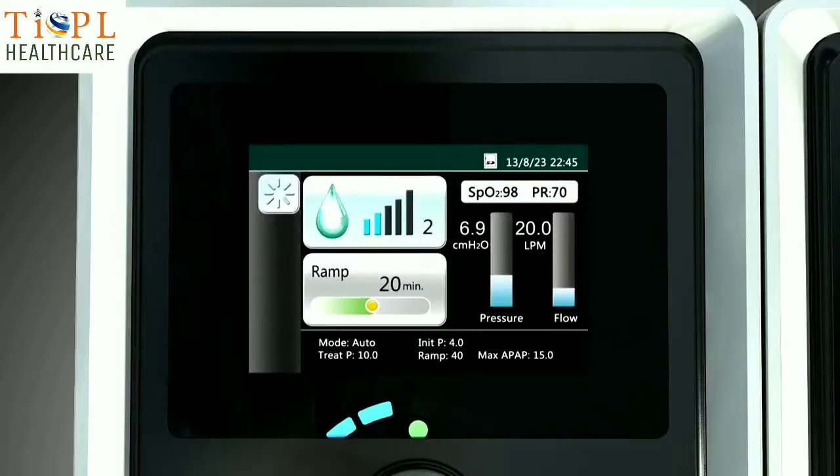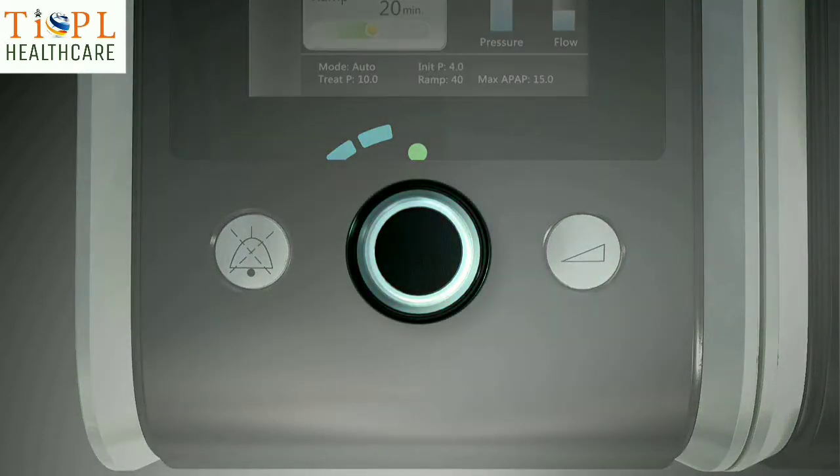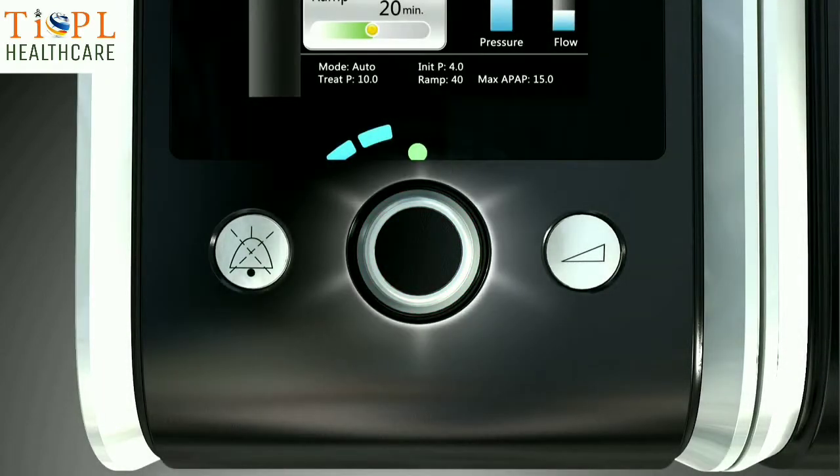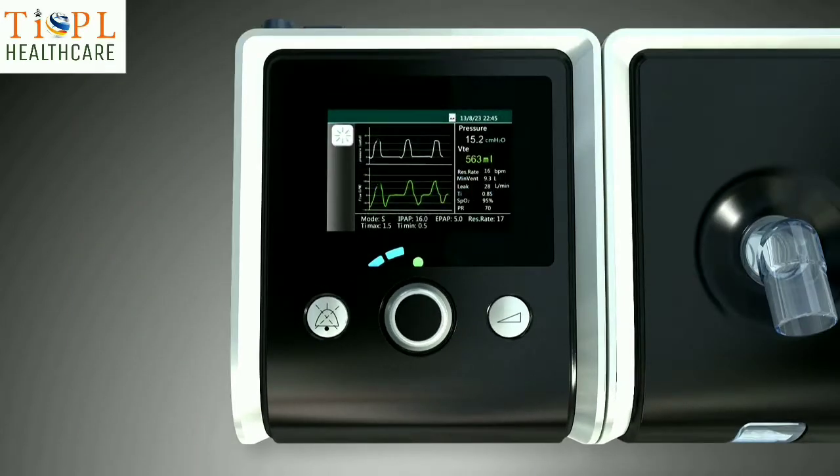With a 3.5 inch color LCD display and exquisite control knob, the BMC ReSmart Generation 2 series brings you unsurpassed operational experience. Real-time flow wave connects us to better patient care and compliance.